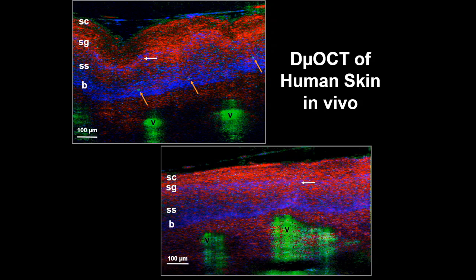I mean, there's a lot of work to be done to make the technology better. And one of the problems that we really have with this is stabilization, because you need to keep the image stable for about a second in order to get the image. Because you need to grab multiple images over time and reconstruct the frequency of motion that exists in the cells. So the hardest part with doing it in the skin is keeping the skin stable. And so that's where all of the research is going right now, is stabilization methods or ways to register the images after they've already been acquired. Awesome.